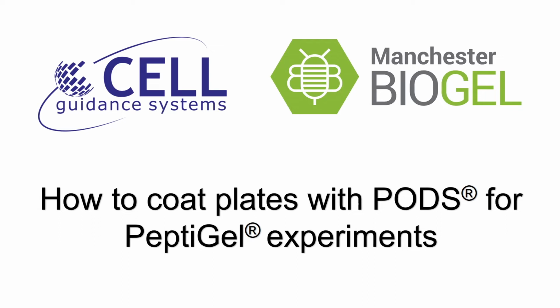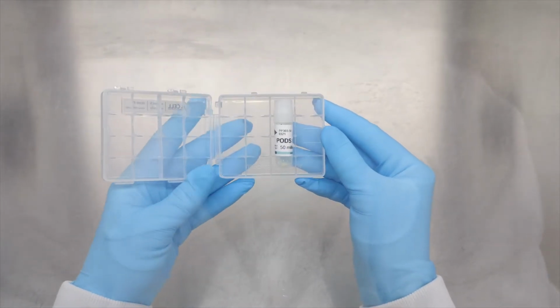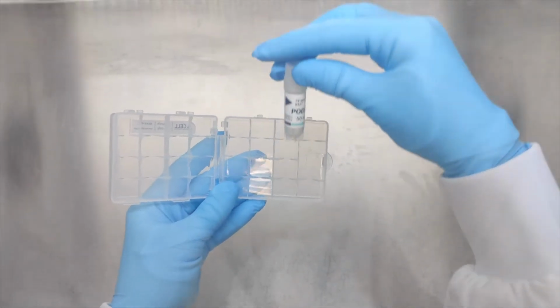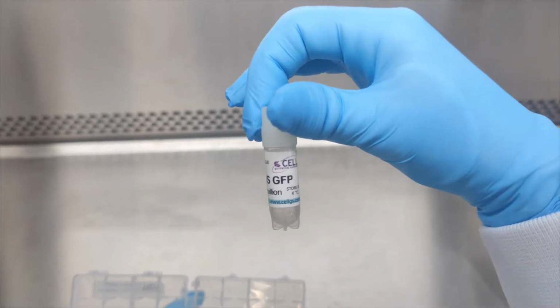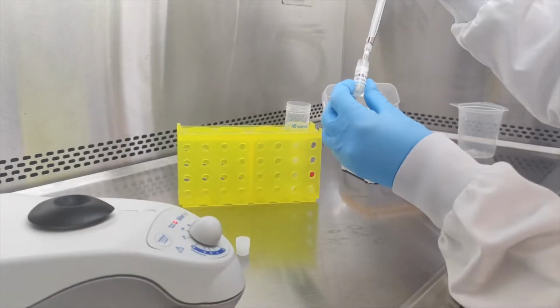How to coat plates with pods for PeptiGel experiments. PODS crystals are shipped sterile and dried in vials containing 50 million or 250 million pods. Always handle pods using sterile technique in a flow cabinet.